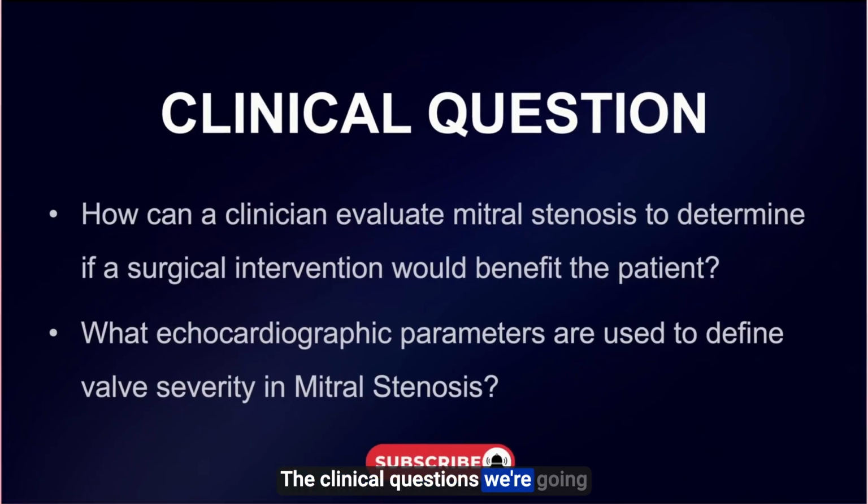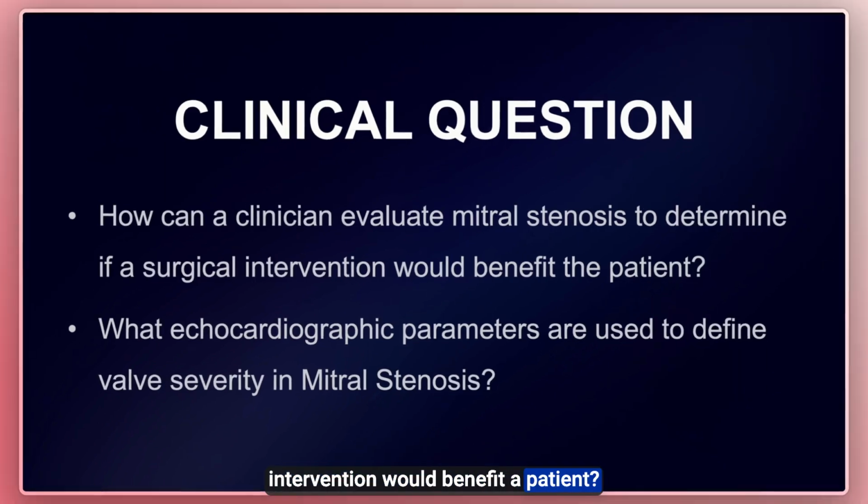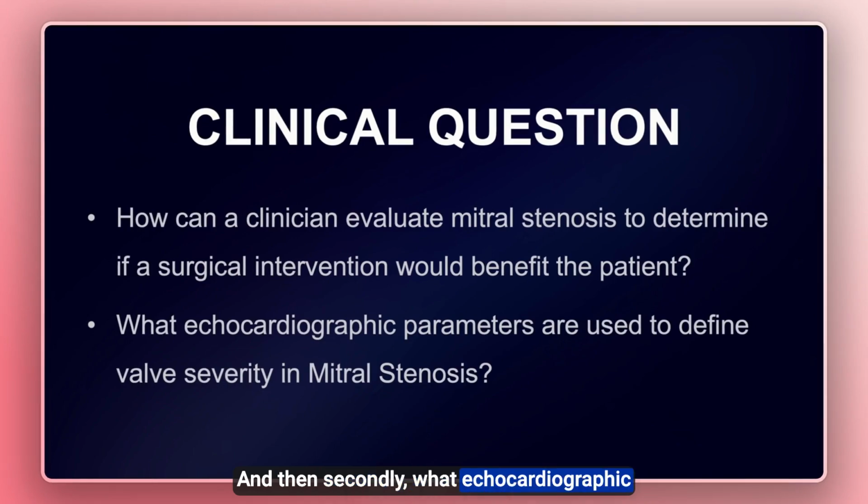The clinical questions we're going to address today are twofold. Number one, how can a clinician evaluate mitral stenosis to determine if a surgical intervention would benefit a patient? And then secondly, what echocardiographic parameters are used to even define valve severity in mitral stenosis patients?